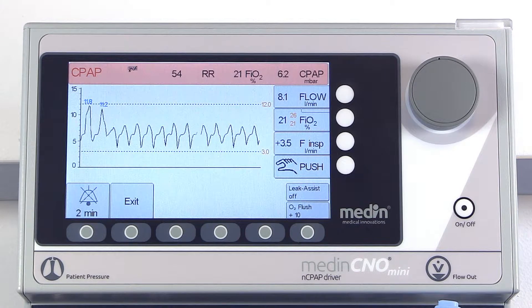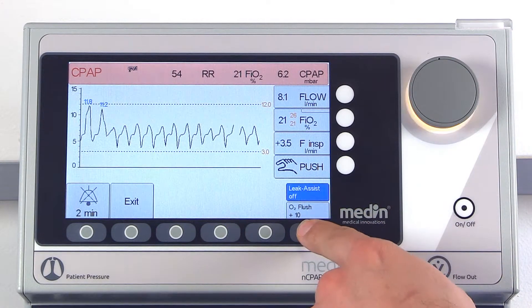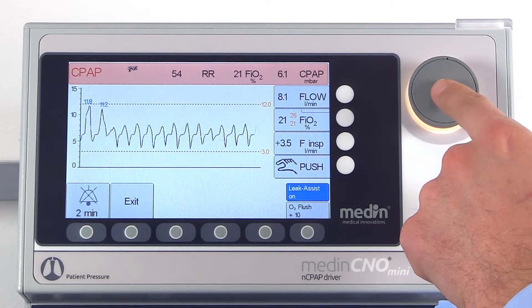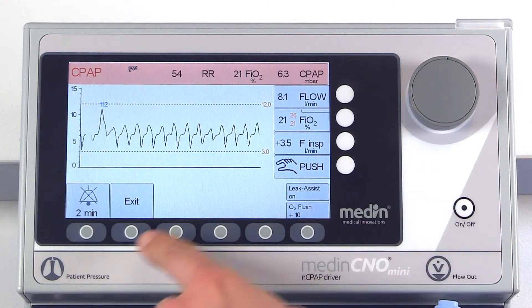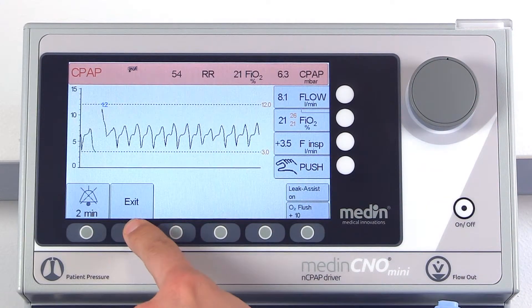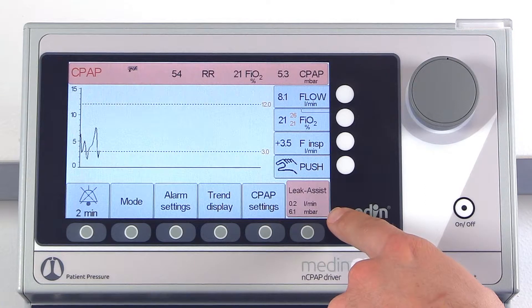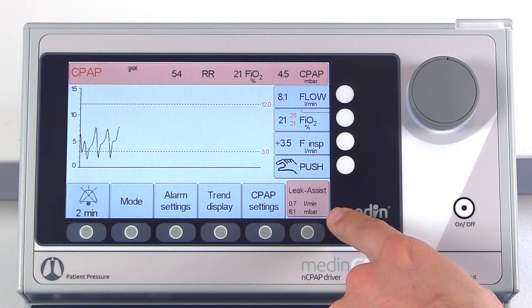Leak compensation can be activated if required. When leak compensation is activated, the current NCPAP pressure is saved as a target pressure.